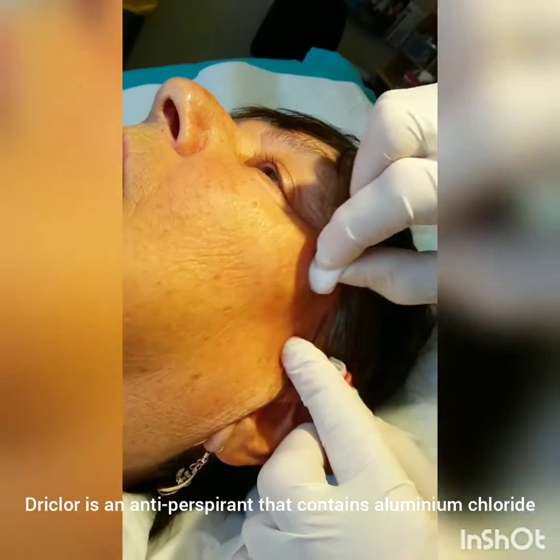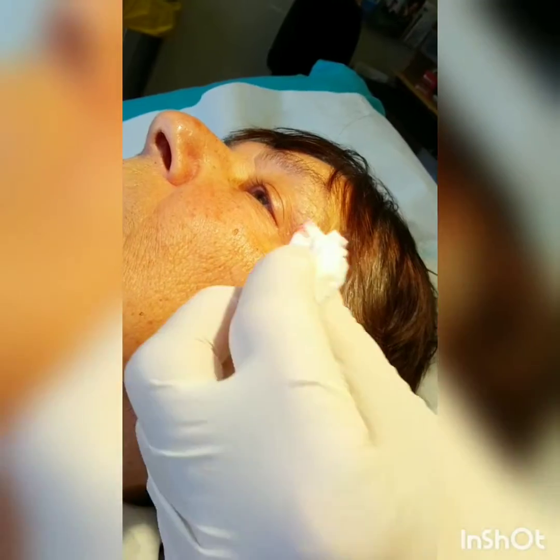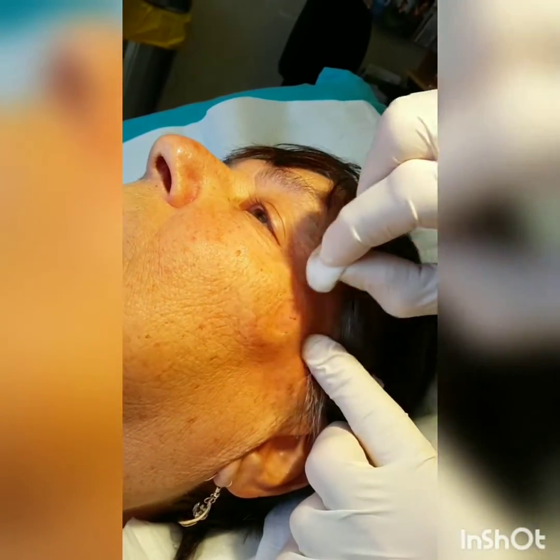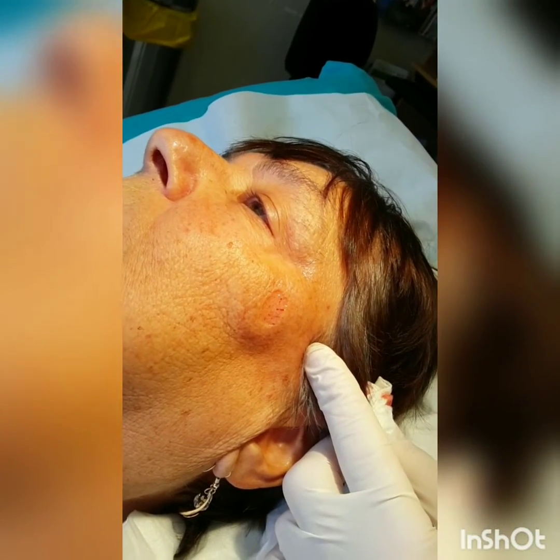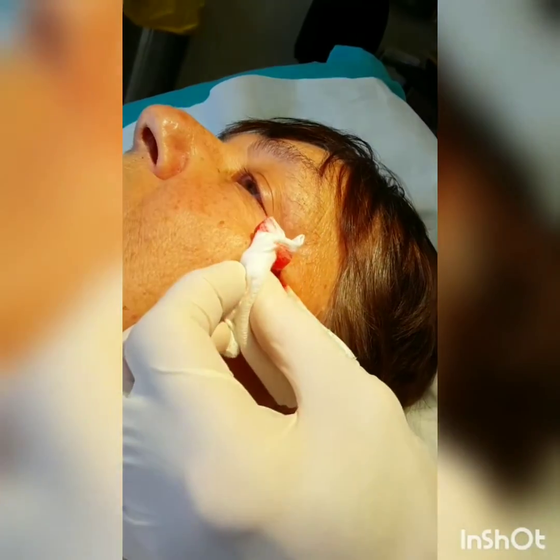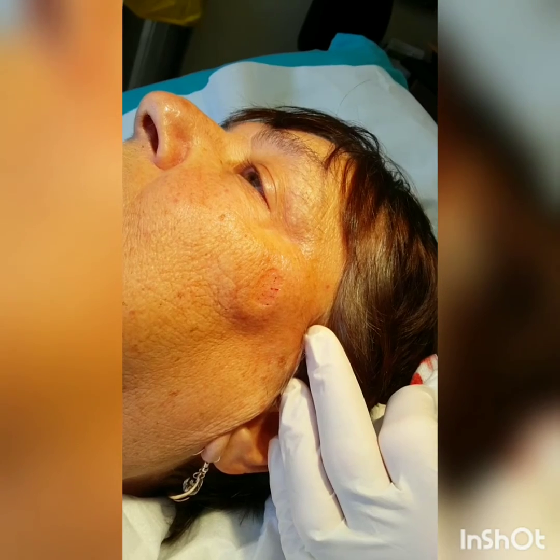Shave biopsies are very user-dependent in terms of one having to be very careful to make sure you have adequate depth so as not to transect the lesion, particularly if it is a melanoma. The other use for a shave biopsy is for removing lesions which appear benign.